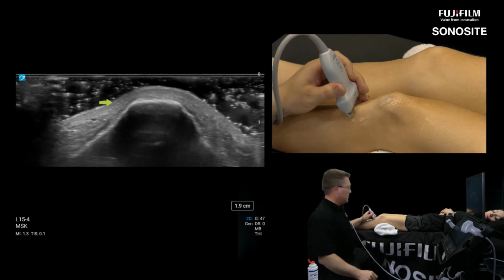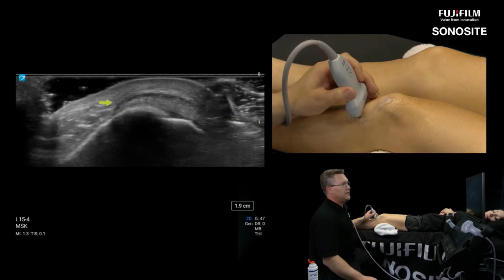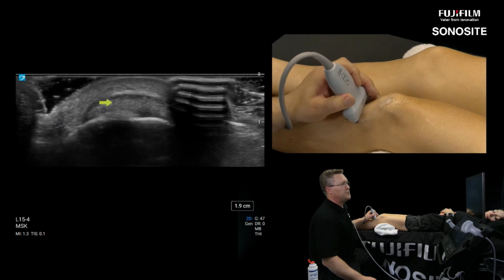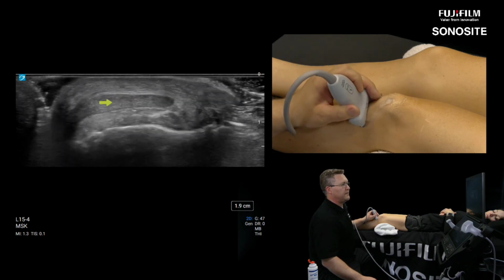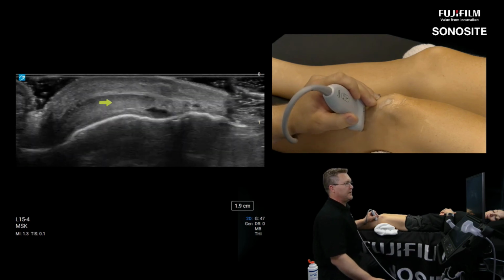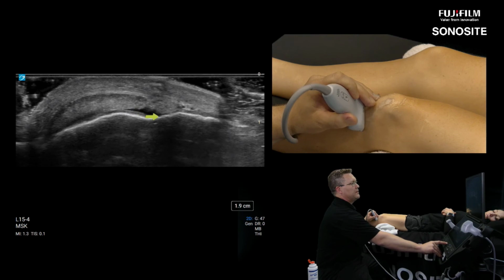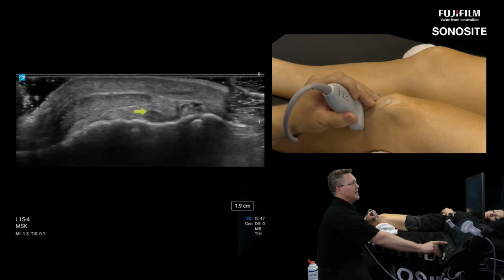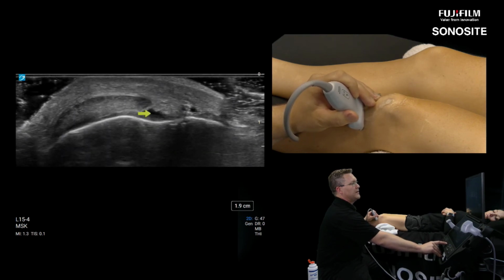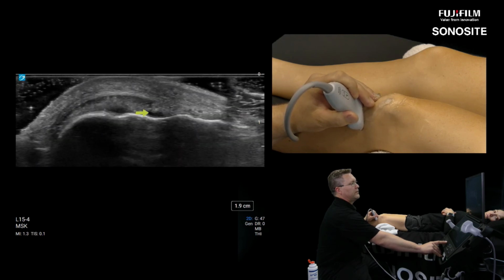Build up your standoff. Use your fingers as stilts so that you're not compressing the superficial infrapatellar bursa or the deep infrapatellar bursa. Give that a shot. And then remember, we're going to see a little bit more of a bursal effusion there laterally, which we see right there. That one sliver of a deep infrapatellar bursa is showing up just in this lateral corner. So simple fluid collections do compress, so we're just going to provide a little compression.